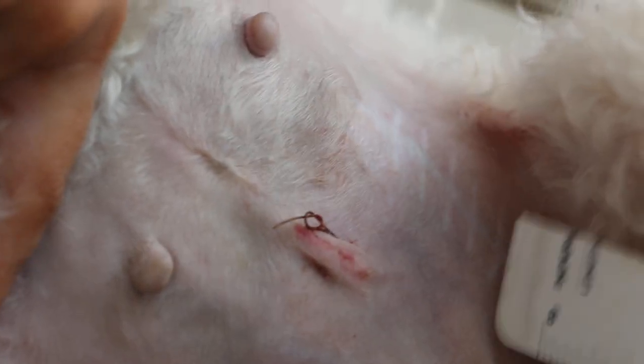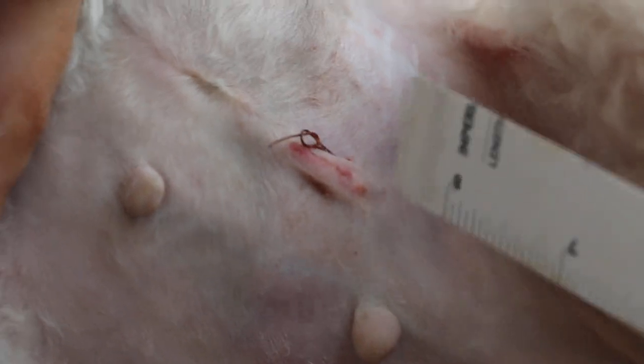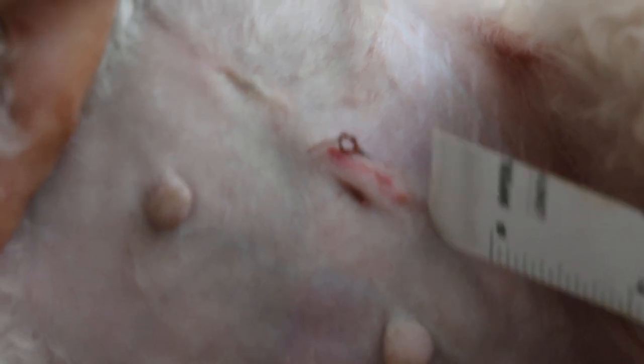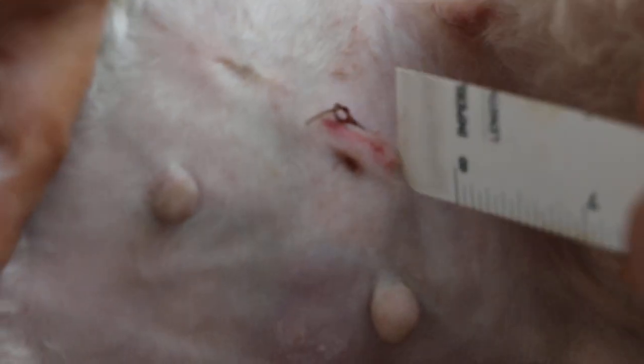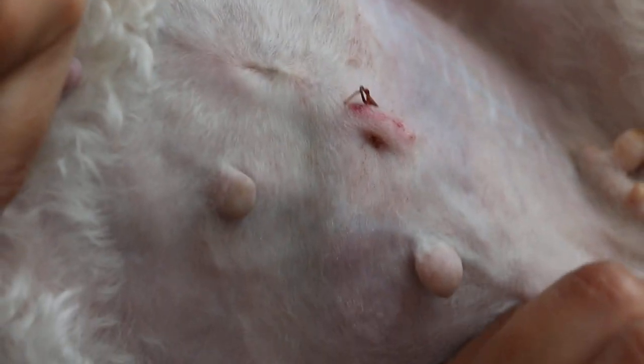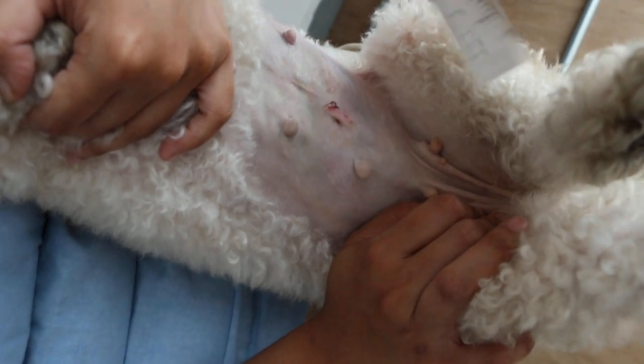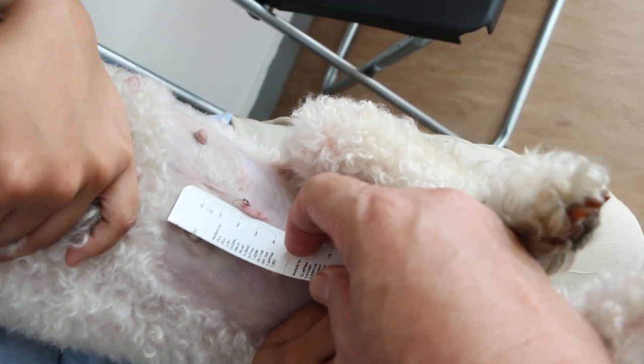With this landmark, you know this area is where you can pick up the ovaries — the ovaries are inside here, along with the uterine horns. You don't need to make a long incision. If you get the wrong landmark and cut too low, you'll need a longer incision to reach the ovaries. If you pull too much, the ovaries will snap and remain inside, which is no good when you're spaying the dog. So in summary: two centimeters from the umbilical scar before you incise the skin.